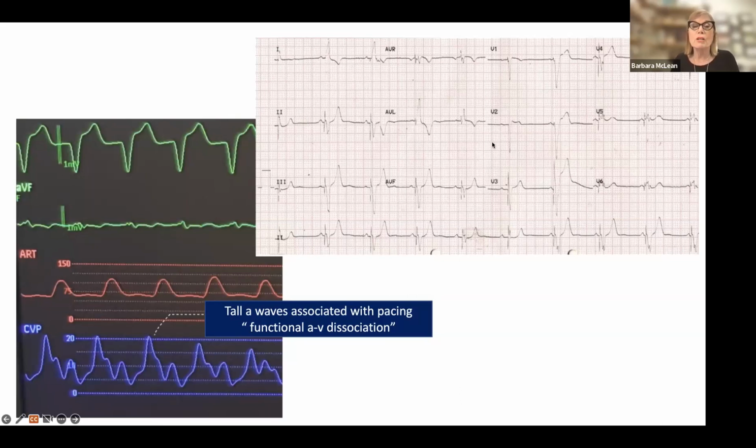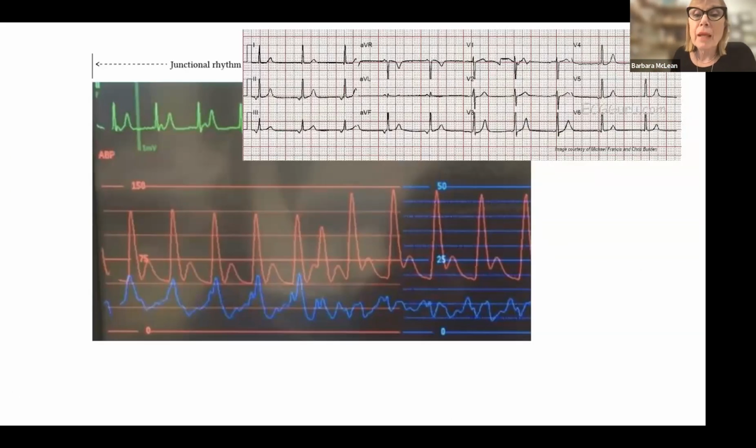And when I look at the patient, I say, oh, he has a big A wave because he's paced. Okay, right bundle branch block, right ventricular hypertrophy, and pacing. Easy things to rule out just by looking at your EKG and understanding these relational dynamics and how incredibly important they are. And then we're going to look at this patient.